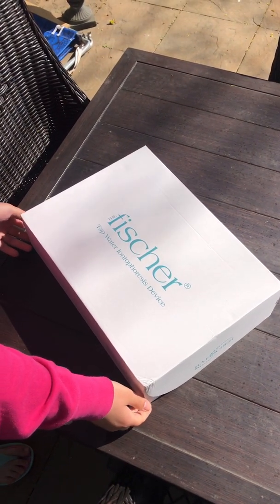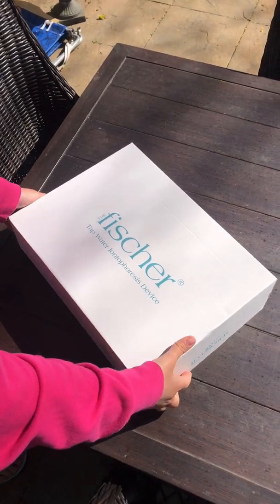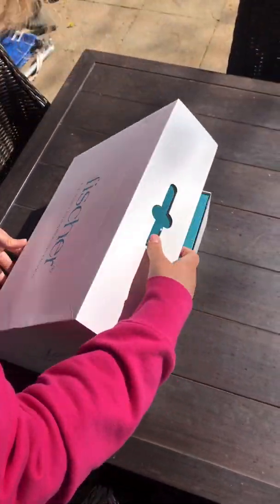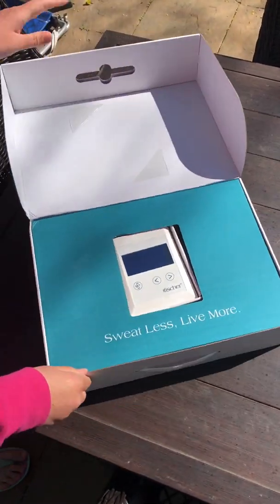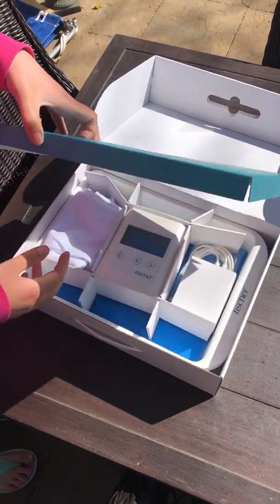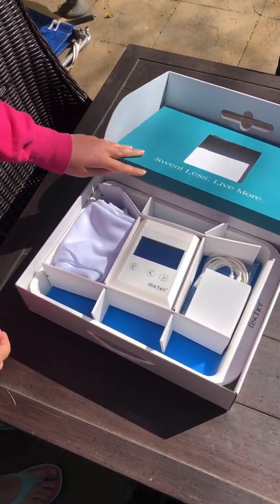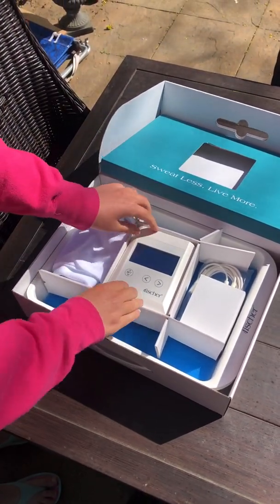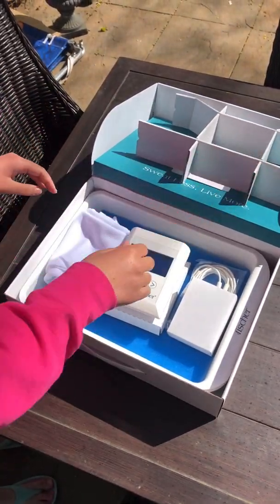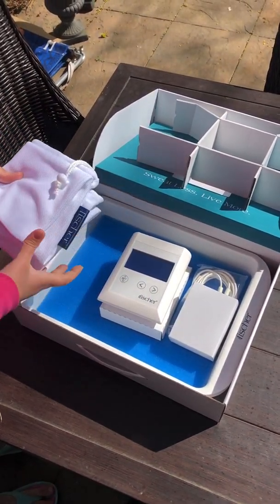I'm going to jump right into unboxing the machine. It's packaged in a really nice cardboard box which is good for safe storage of the materials. Right away the first thing I'm seeing is the actual device itself positioned front and center to show the big improvement from previous models. Everything is separated neatly by a cardboard component, and I noticed right away there is a cloth bag to use for storage of the machine and cables, which seems super nice.